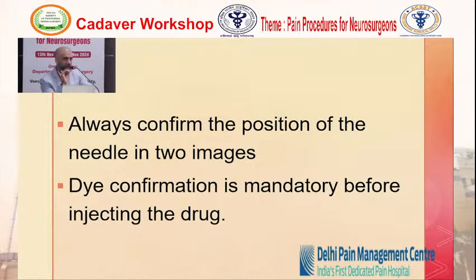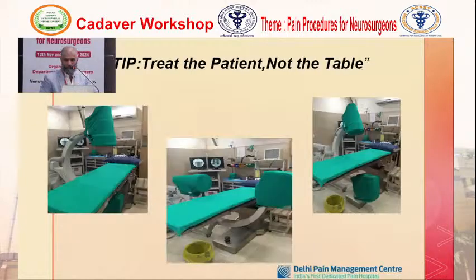You can be in the blood vessel, you can be in the CSF. So for all of that, and whether you are actually able to target the intended area, intended route, is confirmed by the dye. Fine. With that background, let us go forward.